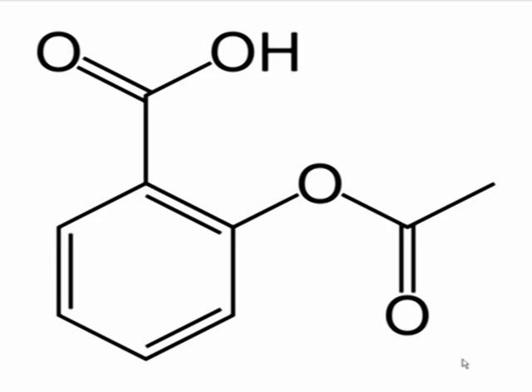Now, if any of you budding toxicologists could recognize this molecule, I'll be very impressed. It's actually an aspirin molecule. And the reason I put it up there is some patients will need very high minute ventilations. If you get an aspirin toxicity that, God forbid, you have to intubate, they're going to need at the minimum 240 cc's per kg per minute.